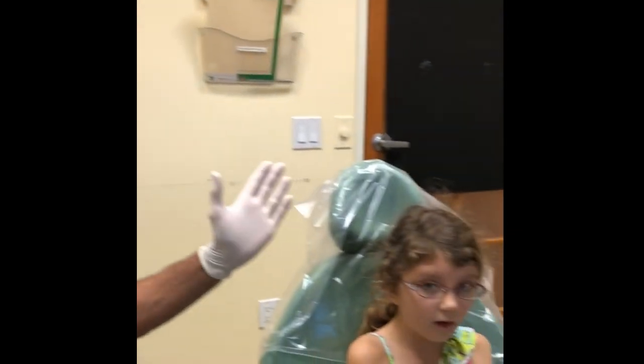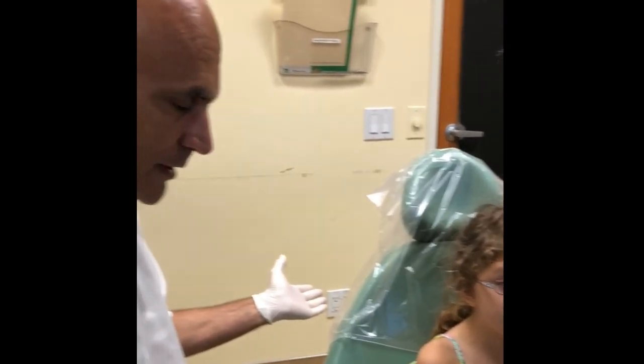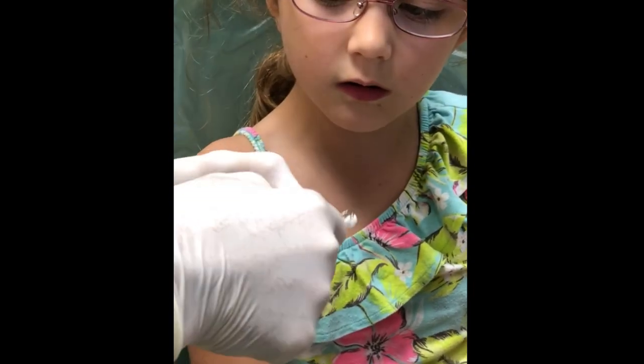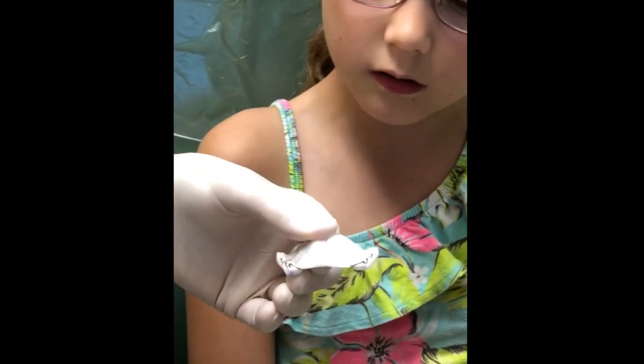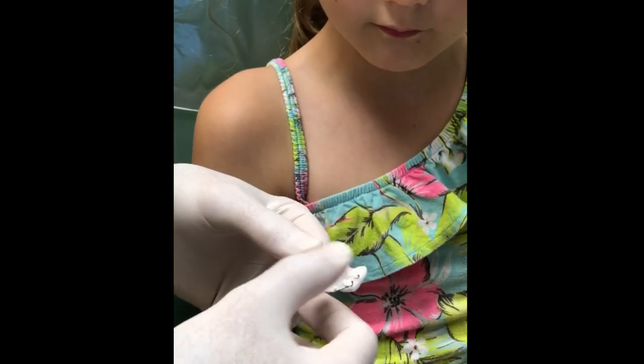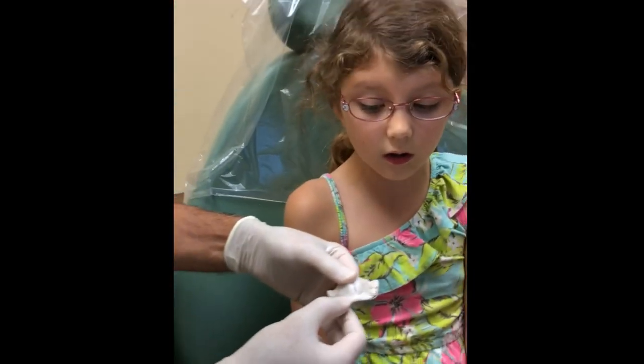The first rule in removing appliances is to be sitting upright — you don't do it while you're lying down. These two hooks, the two wires — you're gonna reach in with your finger and just pull it down. Try each one of them separately and see which one brings it out easier.